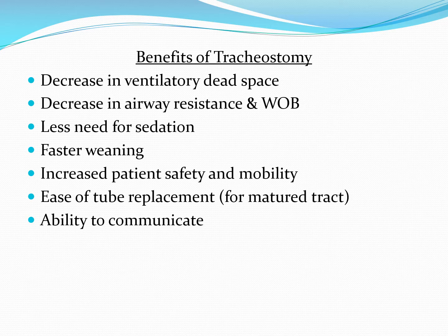Increase patient safety and mobility. Even though patients can accidentally get decannulated, the likelihood that they get decannulated in an unplanned fashion is much lower than the patient's risk who has an endotracheal tube of having an unplanned extubation. So they tend to be much better tolerated, but also they're much more stable in terms of remaining intact and not subject to accidental removal.